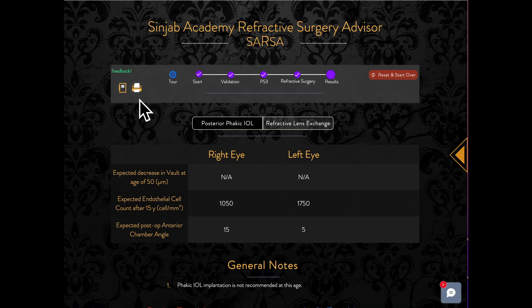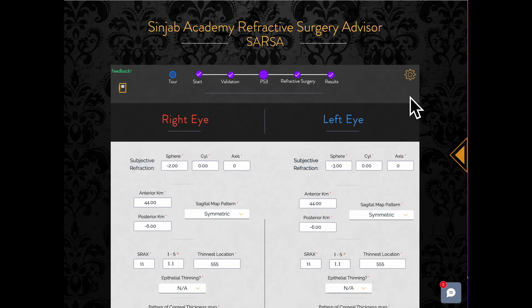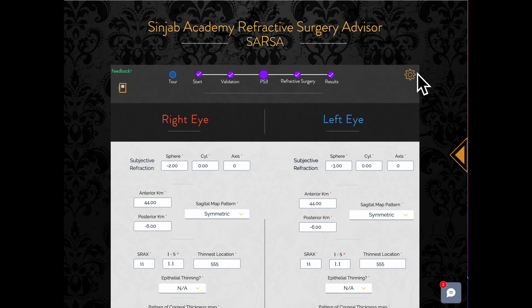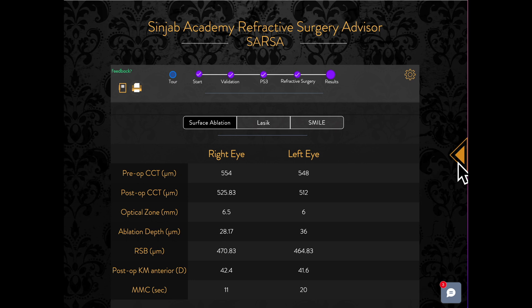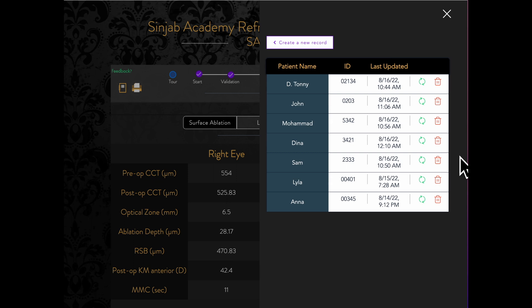You can print the results by clicking the print button. At any step, you can hover over the gear sign to reset the data and start from the beginning, or just reset the step you are in. The program saves a record of your patients. You can check the records by clicking on the arrow on the right side of the screen. You may load a record or delete it.